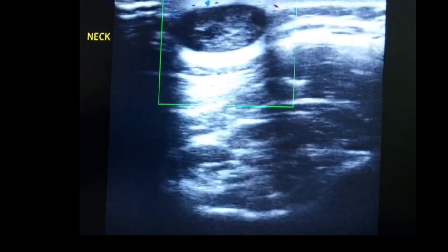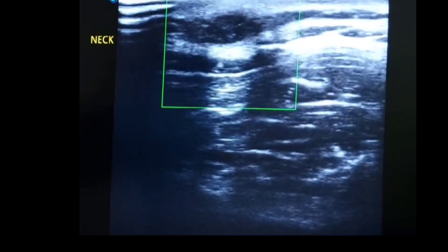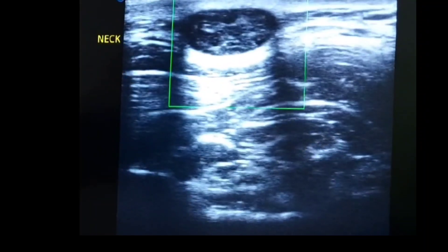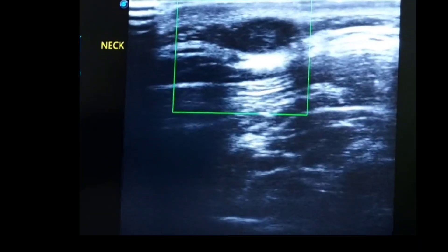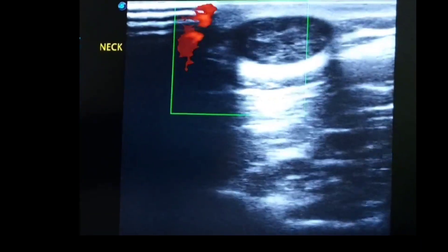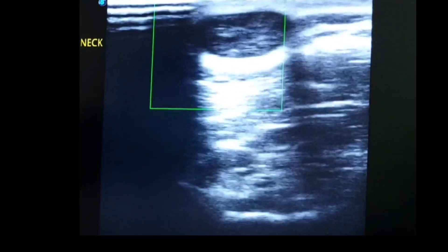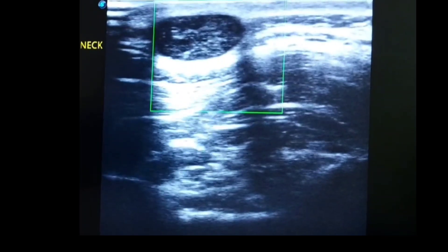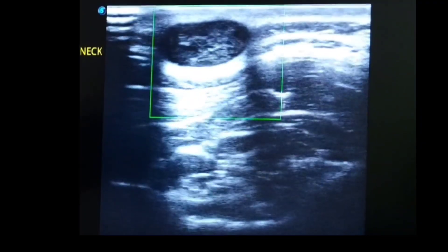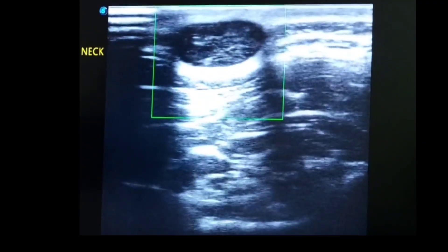There is no vascularity to this sebaceous cyst because these are not supplied by blood vessels. It lies subcutaneously. This is what a sebaceous cyst looks like on ultrasound imaging.